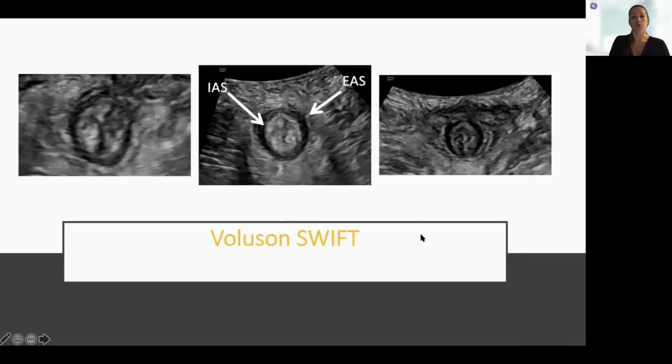And here I will show you 3 patients that have been scanned using Wallace and Swift, the new equipment, and we see again the anal mucosa here in the middle, the black hypoechoic ring, which is the internal sphincter, and the white, which is the external sphincter. And here we see that the internal sphincter disappears at this level, which is a sign of the defect.